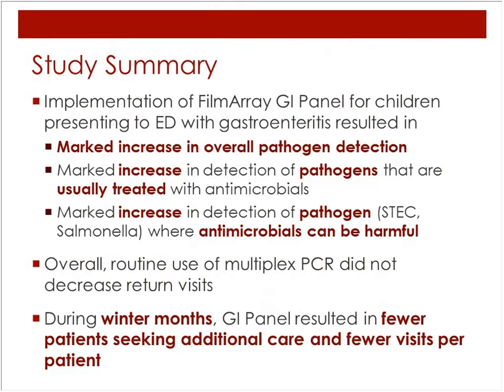So in summary, for the data that we have thus far from the study, implementation of the FilmArray GI panel for children presenting to the emergency department with gastroenteritis can result in a marked increase in overall pathogen detection, as well as a significant increase in detection of pathogens that are usually treated with antibiotics. So there can be an increased number of patients that can be appropriately treated with antibiotics. Also, and more importantly as well, there was a marked increase in detection of pathogens, such as the Shiga toxin-producing E. coli, where antimicrobials can be harmful, and where it is important to identify these sort of pathogens.